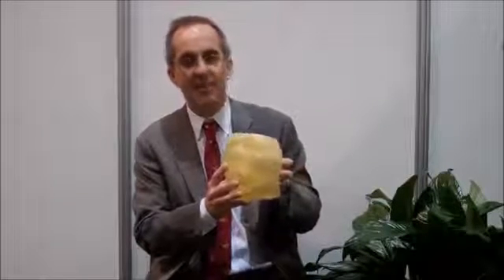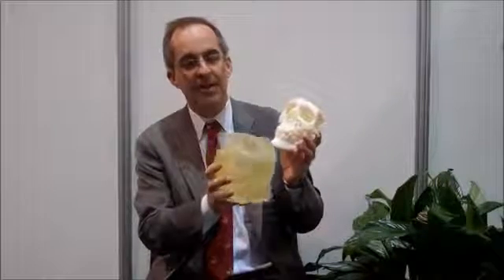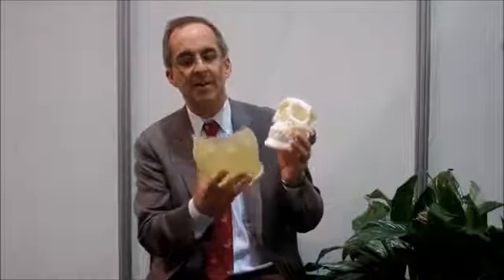Another interesting area for future directions is we can actually 3D print off of MR models. These were made off of CT. But if we're going to actually 3D print models and look at soft tissue changes, we may in fact want to use MRI because it has no radiation, and it's easy to acquire those data on a patient like Carmen and look at the soft tissue changes over time with MRI or even 3D ultrasound, where we can get excellent data with no radiation. So these are some of the rationales for the 3D printed model.